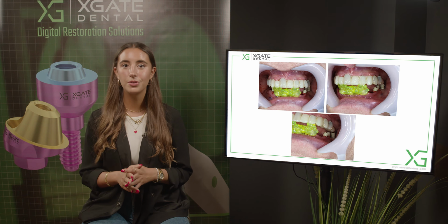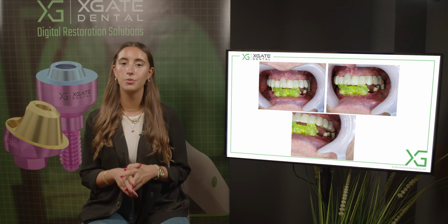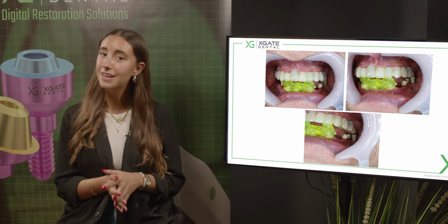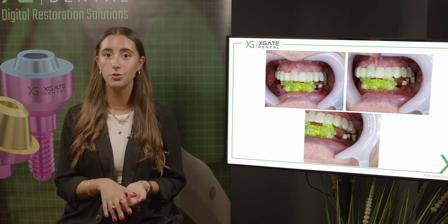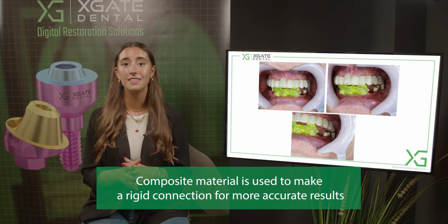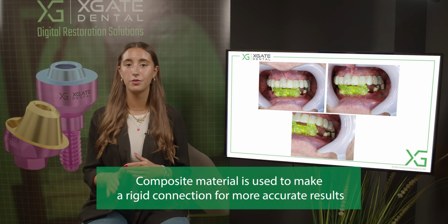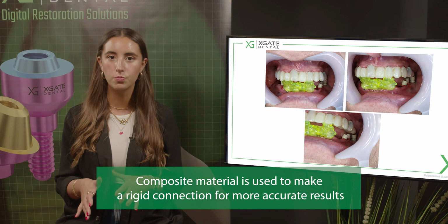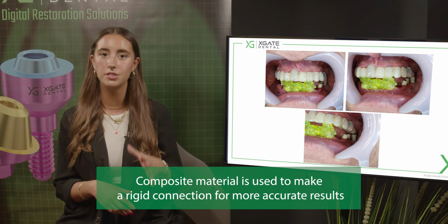Here you can see that we took off some scan abutments and we've added on some of the scan abutments composite material. The composite material is in occlusion, and you can see that the height of the scan abutments is exactly 6 millimeters. This is probably the smallest height for the restoration that you want to have. In the anterior part, you have much more. You can see the height of the composite material.